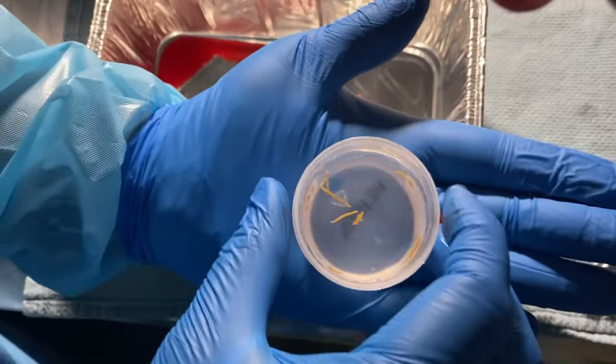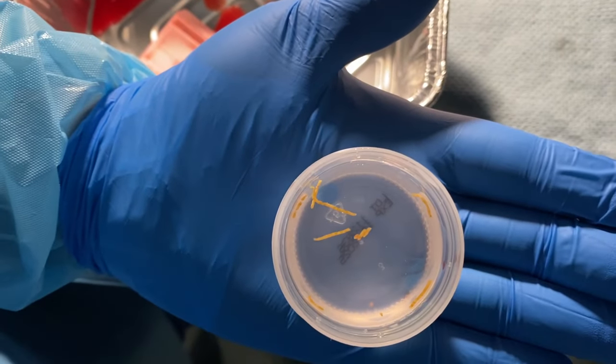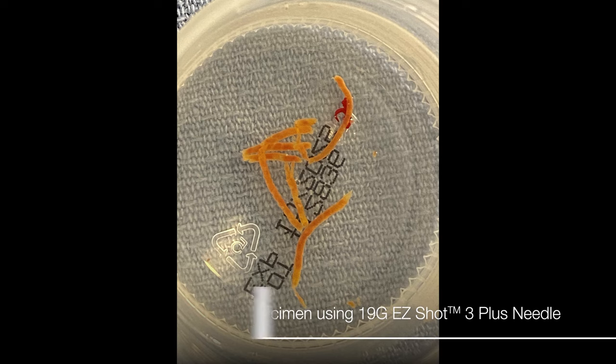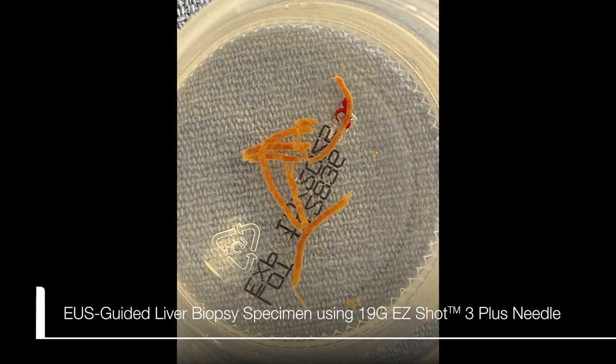The cups are labeled as left lobe of the liver and right lobe of the liver separately and are sent to surgical pathology for further processing. Visible tan brown fragments of liver tissue are examined for specimen adequacy, and the need for further passes is determined accordingly.